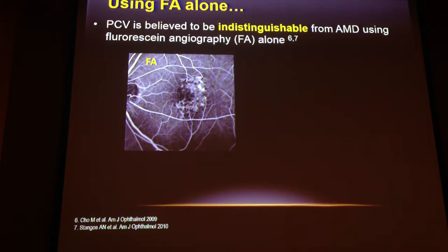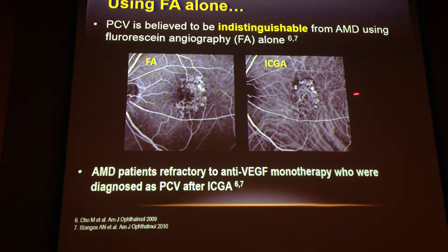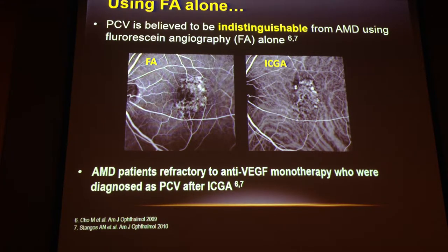What if we use just fluorescein angiography alone? You just see some hyperfluorescence, obviously some CNV on the fluorescein angiogram. Only when we do an ICG angiogram do we see the polyps as well as the branching vascular network. There are reports of patients diagnosed as AMD who were refractory to anti-VEGF monotherapy, subsequently diagnosed as PCV only when indocyanine green angiography was performed — in one case, treated with anti-VEGF for 18 months before an ICG angiogram revealed polyps. We tend to do more ICG angiograms in Asia because we know the prevalence is higher amongst our populations.